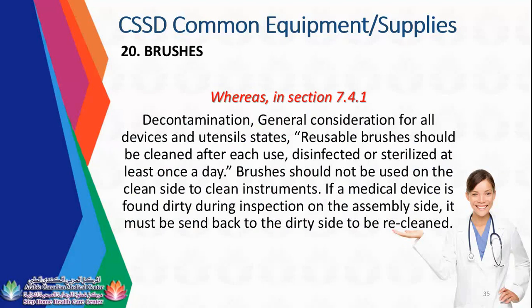Brushes should not be used on the clean side to clean instruments. For example, guys, you are in the inspection area and you see some remaining blood in the instruments. You should send it to the decontamination area again, not just brush the clean instruments to remove the remaining blood. No, you need to send it back to the decontamination area. So brushes should not be used on the clean side to clean instruments. If a medical device is found dirty during inspection on the assembly side, it must be sent back to the dirty side to be re-cleaned.